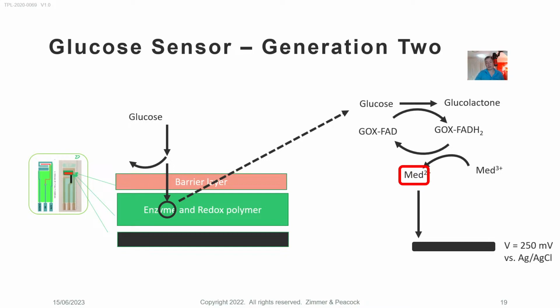It's just a slight thing that actually some generation 1 sensors, which you would argue are not as good as some generation 2 sensors, actually have better clinical data.